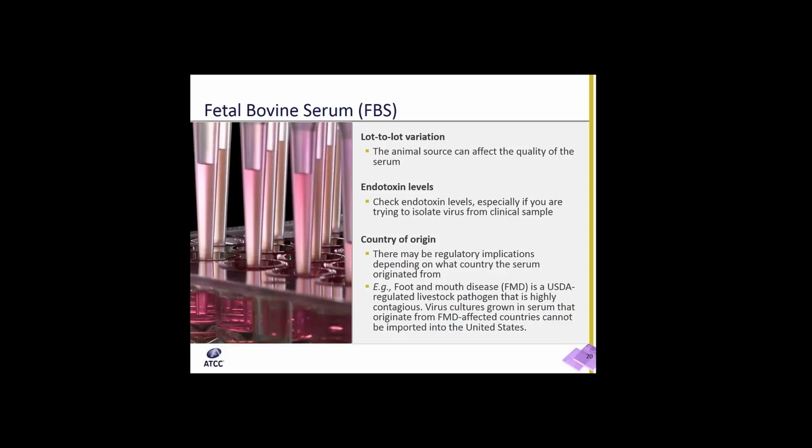Also, remember to check for endotoxin levels, especially if you're trying to isolate virus from clinical specimens, because that may actually detract from a good isolation. We also, in our experience, find that the country of origin is important, as there are regulatory implications depending on what country the serum originated from. And while all reputable suppliers test their products for infectious virus that may be present, there are instances when certain viruses are difficult to get rid of.